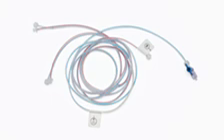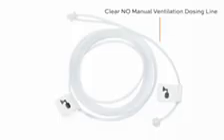The gas lines consist of a red NO injection line that is used to deliver nitric oxide to the mechanical ventilation circuit. A blue sample line is used to sample gas from the inspiratory limb of the ventilator circuit, and a clear NO manual ventilation dosing line, which is used to deliver nitric oxide to the manual ventilation bag NO adapter.